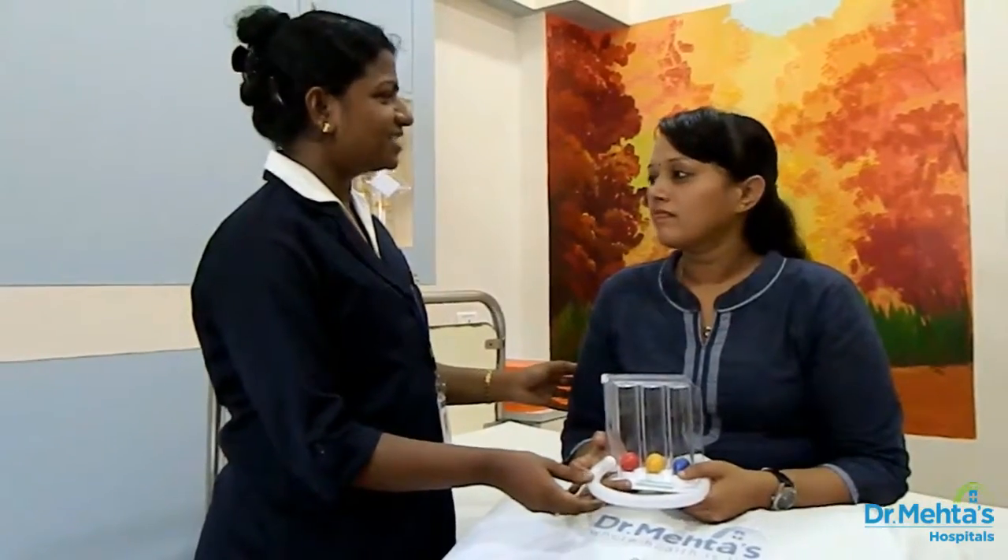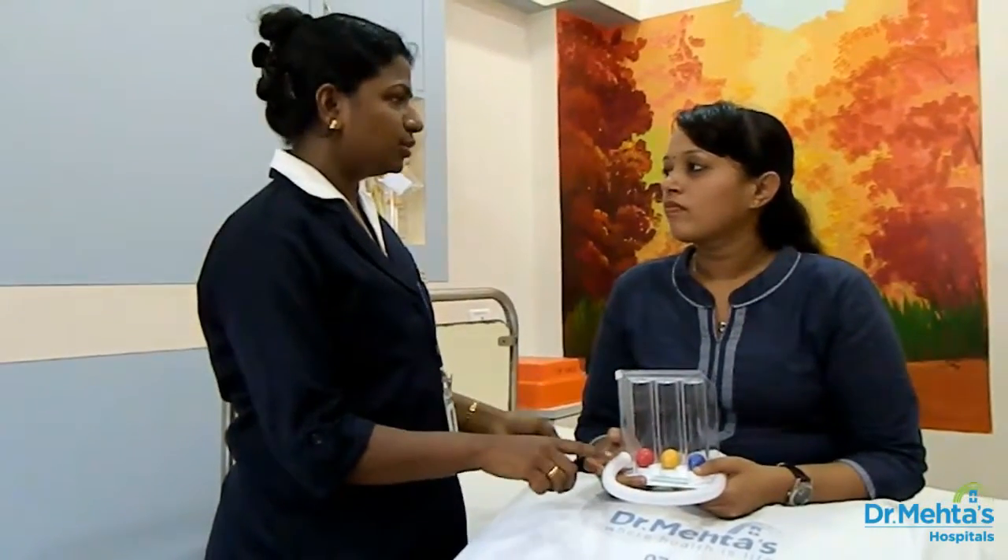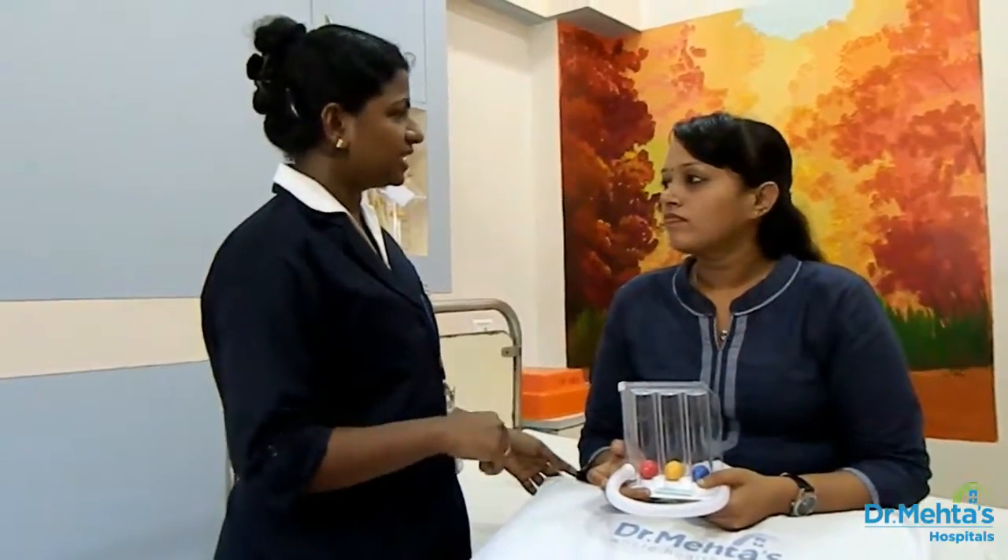Today you have learnt about this spirometer exercise. Please do it every 1 to 2 hours in a day till you come for the next visit. Dr. Mekas family wishes you for a speedy recovery. Thank you.